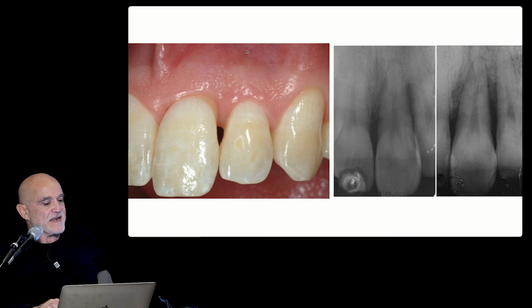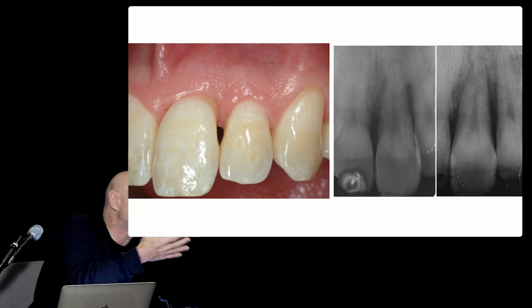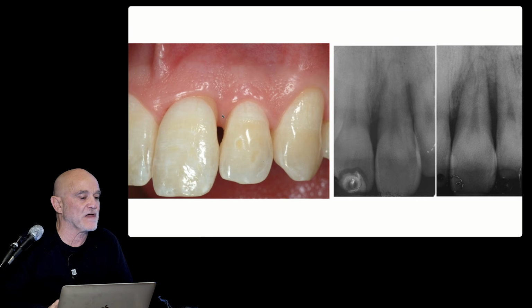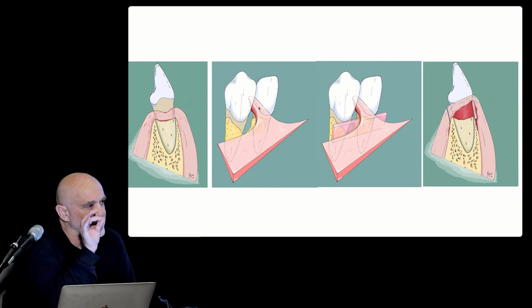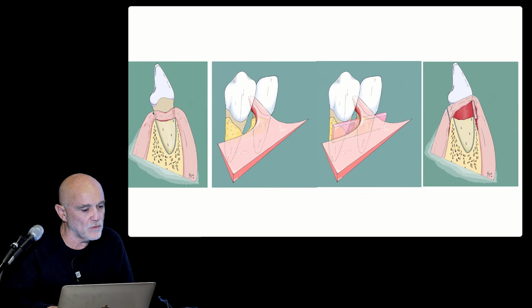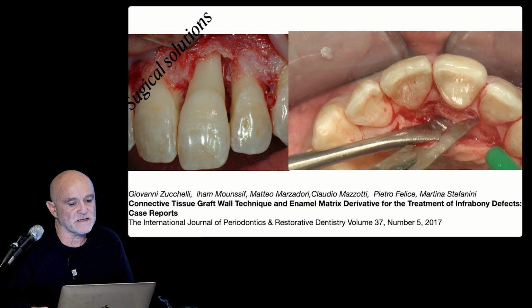Here there is a very, very thin, small, but intact soft tissue isthmus. That means that I can preserve this by making what? The palatal incision, remember? Because by making the palatal incision, even if this isthmus is very thin, the soft tissue healing depends on how long I can bevel the incision in the palatal aspect and is not in relation to the width of the isthmus that in this case is extremely small.